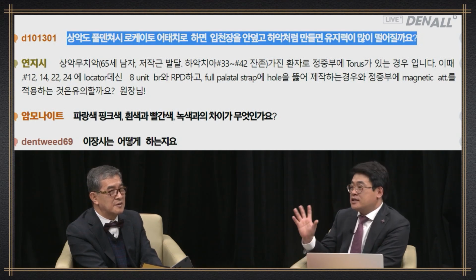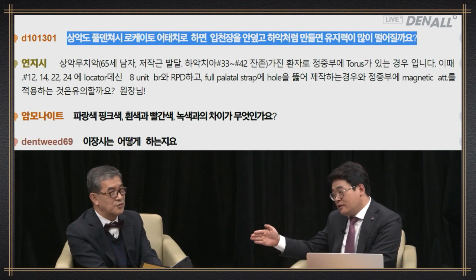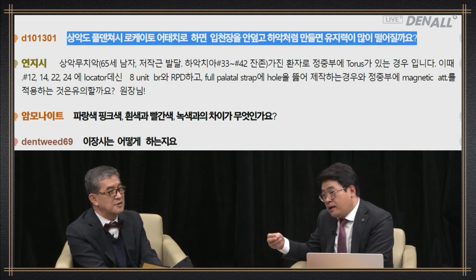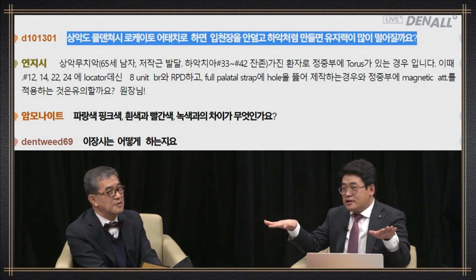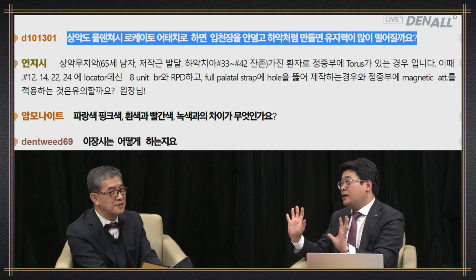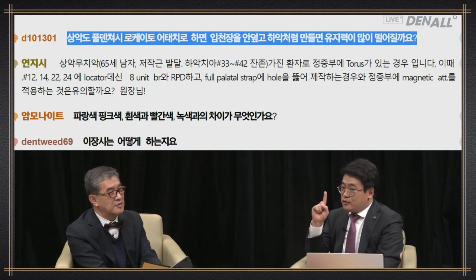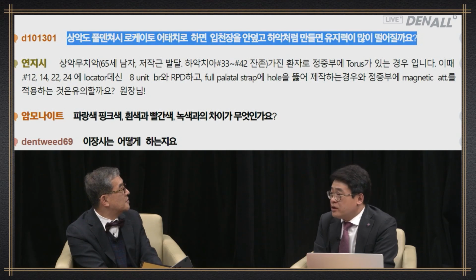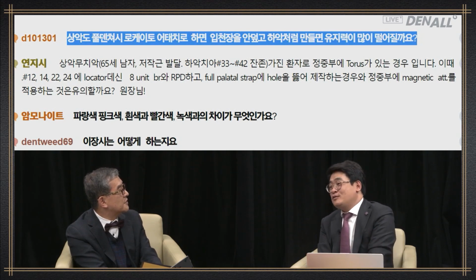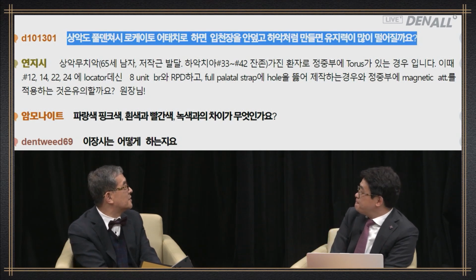And there are different types of the palate. For people with a deep palatal vault, we can use the AP palatal strap type. And if it is flat, there is no horizontal stability. So if possible, you need to cover the palate to disperse the occlusal force. In the upper, the palate is where it occurs most efficiently. If you punch it out just because the patient complains of discomfort, you don't know what's going to happen. Therefore, I recommend covering it.